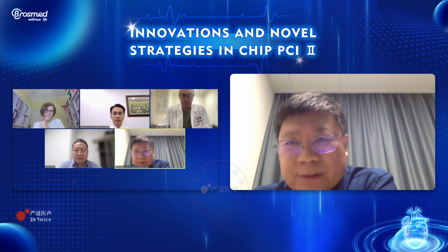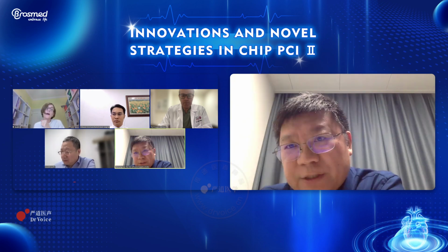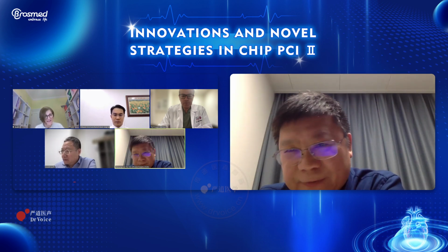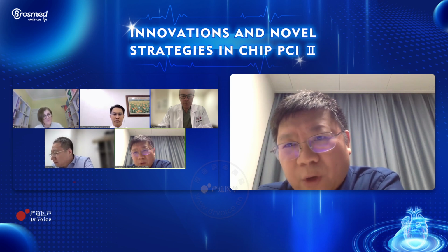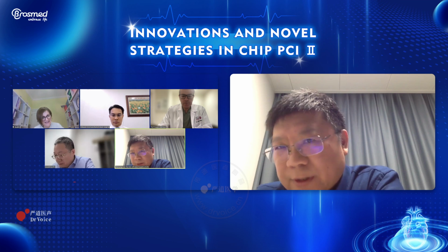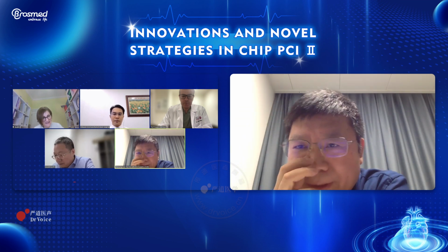So sometimes we choose Judkins left, Judkins left 3.5 or just Judkins left 4. The guiding catheter may work sometimes.